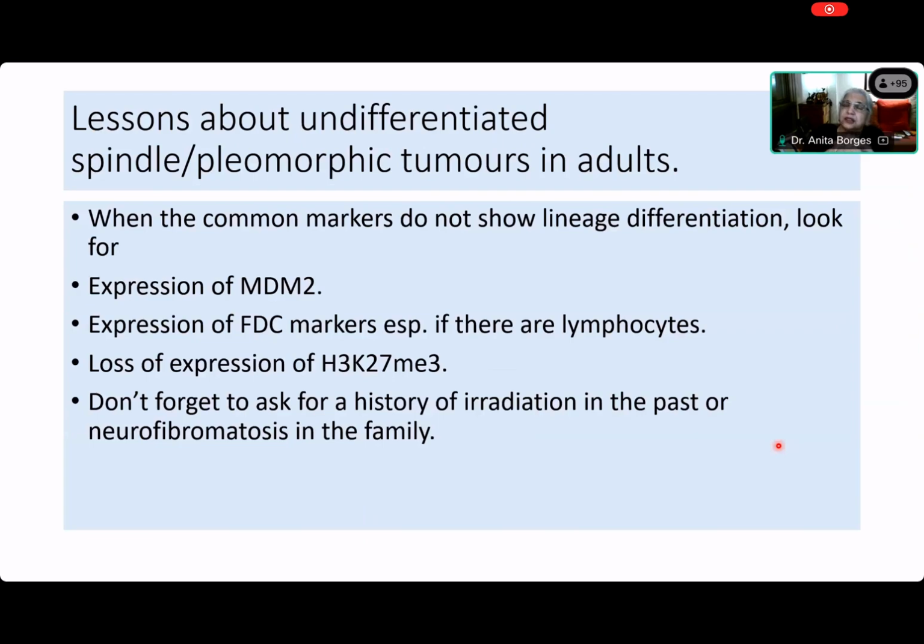You cannot miss a nodular fasciitis, or at least miss myofibroblasts. All right. The ulcer, I just put it there so that you could notice what happens in a lesion that is repairing, or acute inflammation that is undergoing reparation.